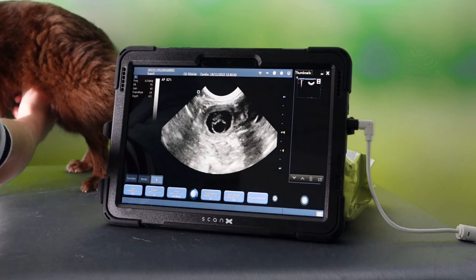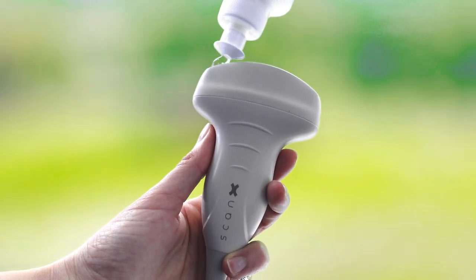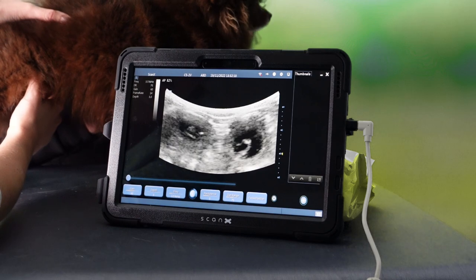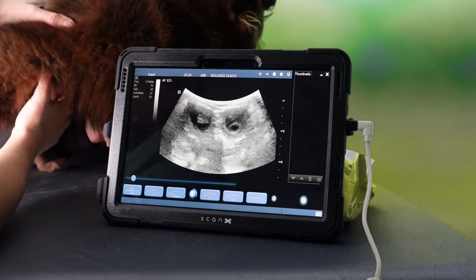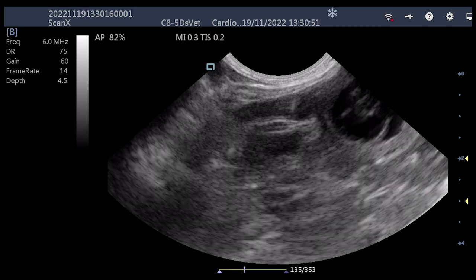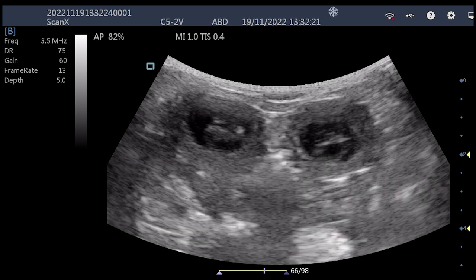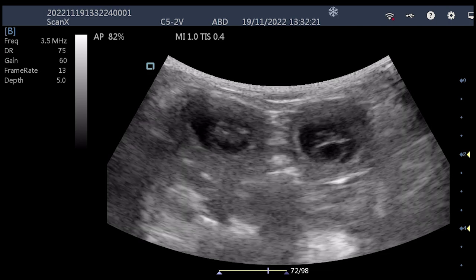First up is the microconvex probe on the ScanX, followed by the convex probe. Here are the exported clips one after the other — microconvex first, starting at the bladder. Gestation sacs then come into view, beautifully clear. Frequency is at 6 MHz here, which is the centre of the probe's range. Now with the convex probe on its central frequency of 3.5 MHz, you can see there is a drop in resolution. We still get all the information we need, but we don't have that same level of clarity.